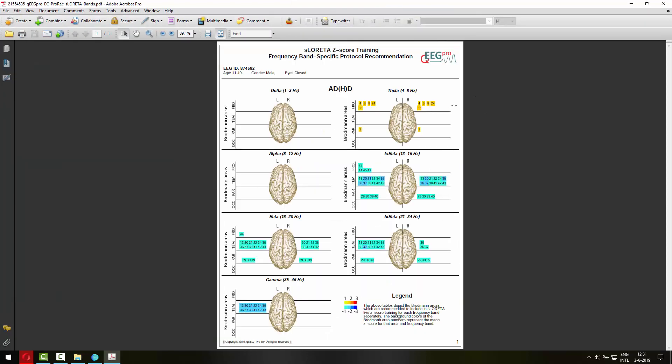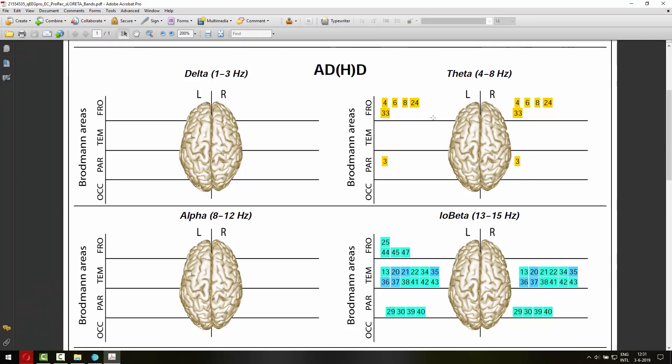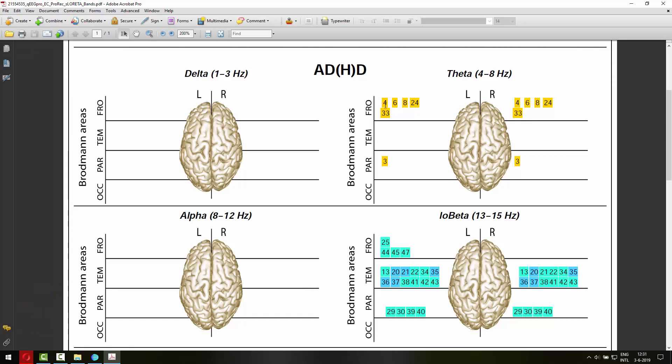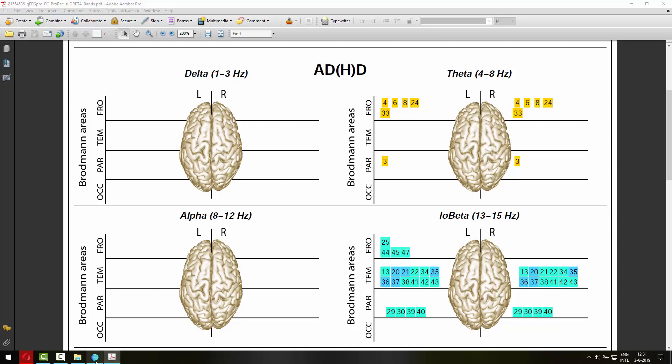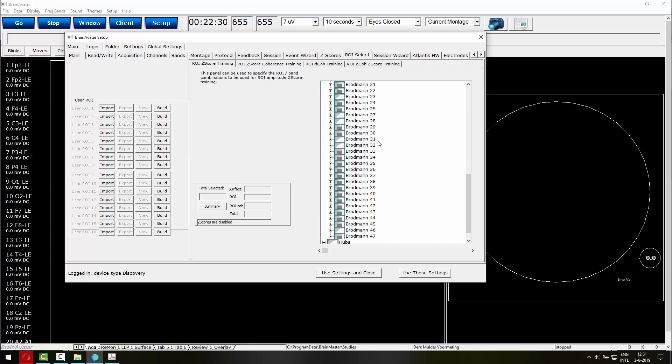So let's focus on Theta for example. You can see that Broadman area 4, 6, 8, 24 and 33 are recommended to include in the Brain Avatar live Z-Score training, both on the left and the right side. So if you go to the Brain Avatar software, you can see that Broadman area 3 on the left for Theta is selected and on the right as well.